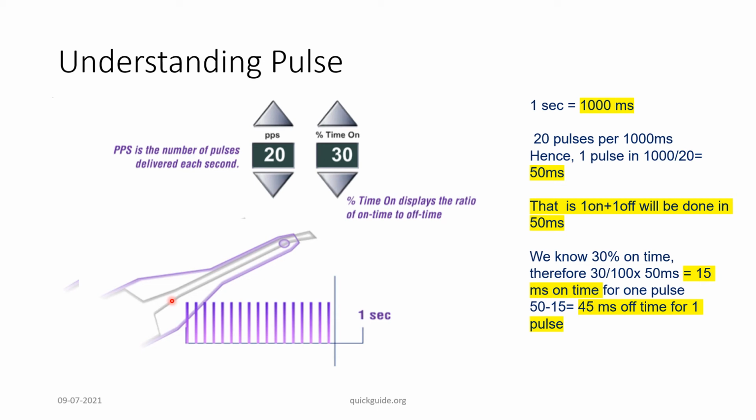And what does this 45 milliseconds of resting time help to achieve? It helps to keep the phaco tip cool. And also remember, phaco is done with a jackhammer effect, and we discussed this in part 2. So when there is a jackhammer effect, there will be some amount of repulsion and chattering. So that resting time helps the nucleus pieces to build up and come again back to the tip. So it helps the fluidics to build up. It helps to improve the followability.